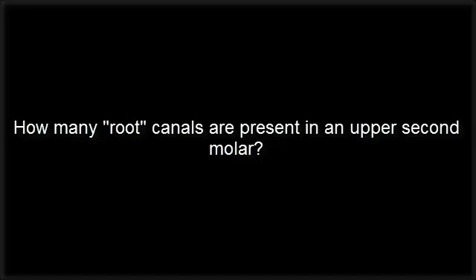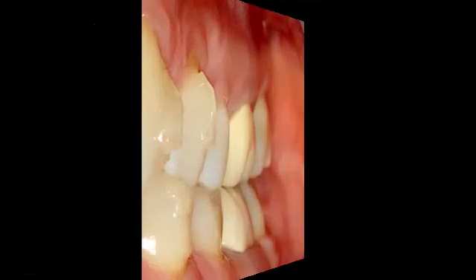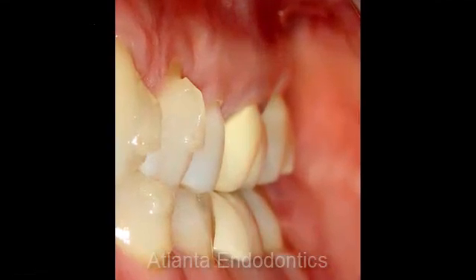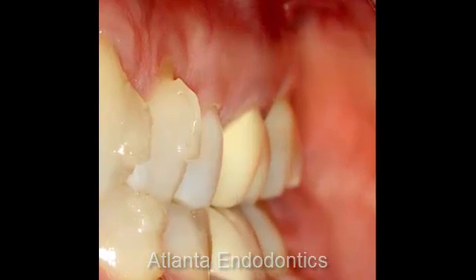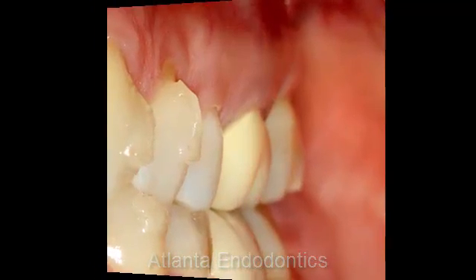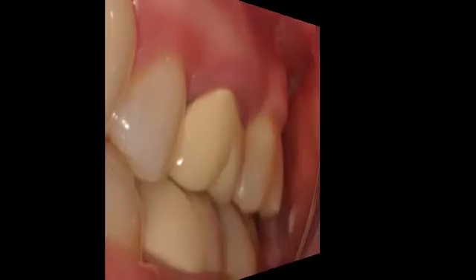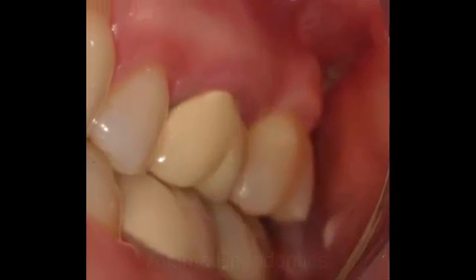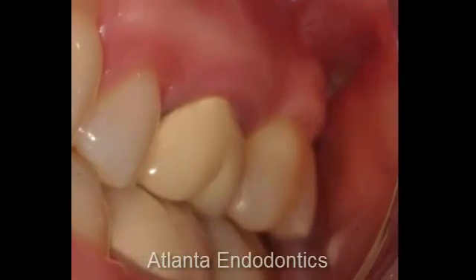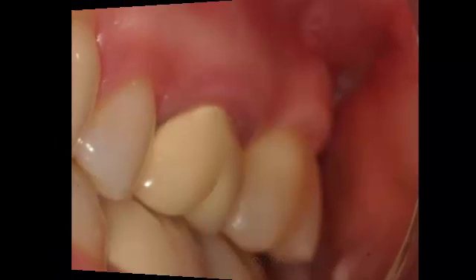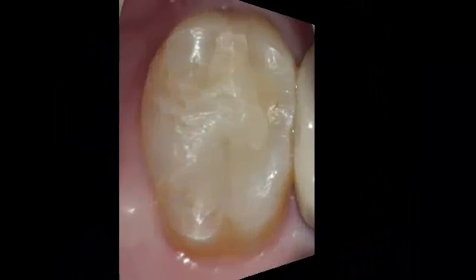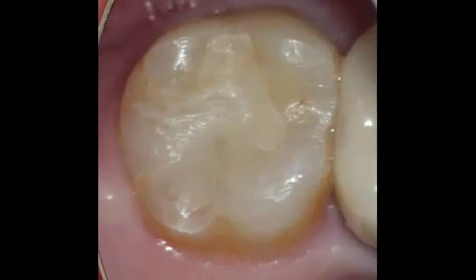This is an interesting case that I treated a few years ago, and it certainly reinforces the need for the dental operating microscope in modern endodontics. It also reinforces the need to have cameras attached to the microscopes, because you never know when you're going to run into something interesting, be it a fracture or aberrant anatomy inside of the tooth.